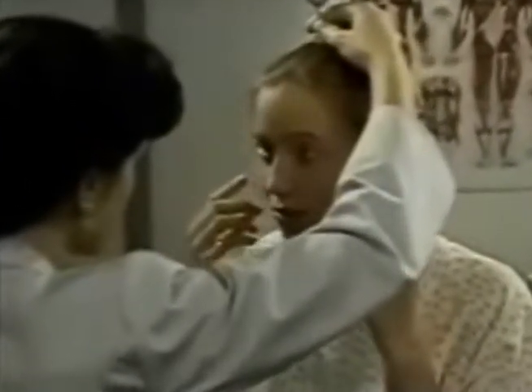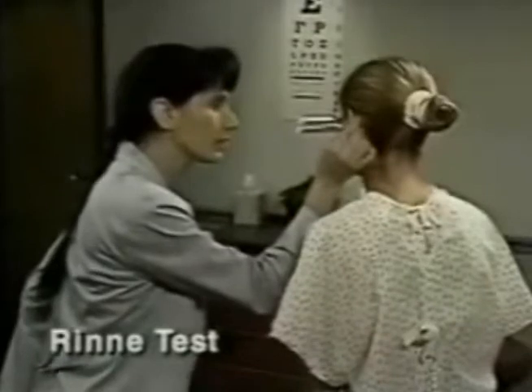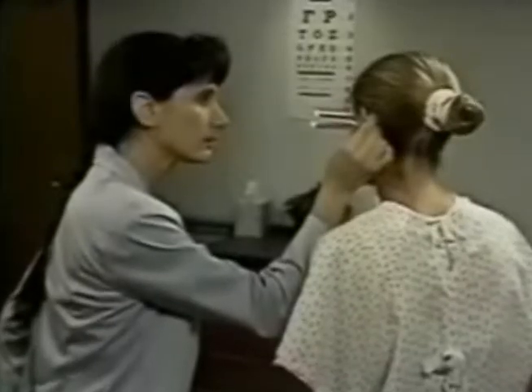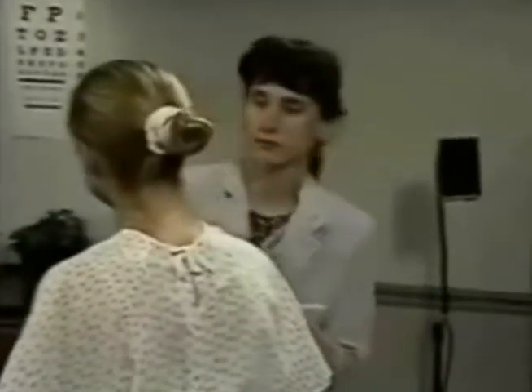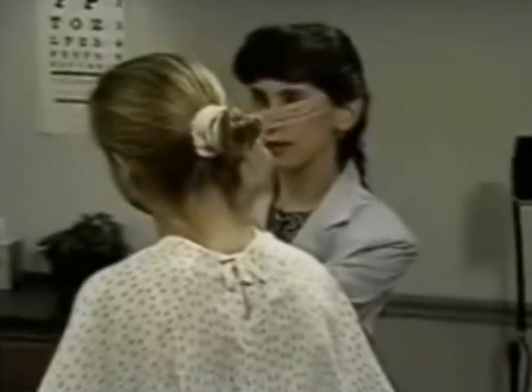Ask where the patient hears the sound, normally in both ears or the midline. To do the Rinne test, place a lightly vibrating tuning fork on the mastoid bone behind the ear. When the patient indicates that the sound is no longer heard, quickly place the vibrating fork close to the ear canal. Normally, the patient can hear vibration longer through air than through bone. Repeat the test on the other ear.